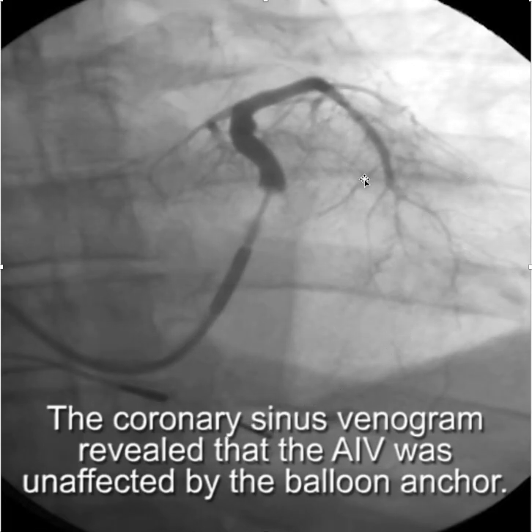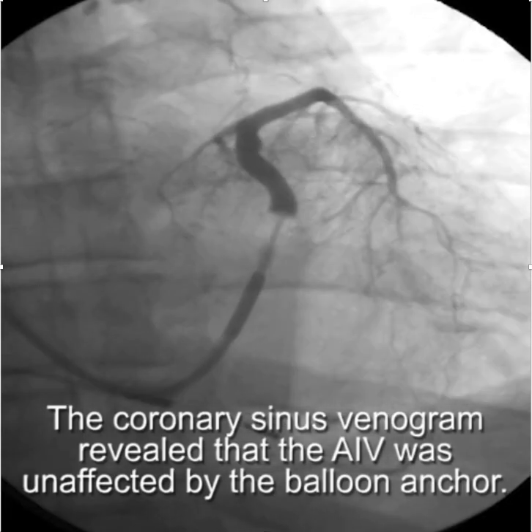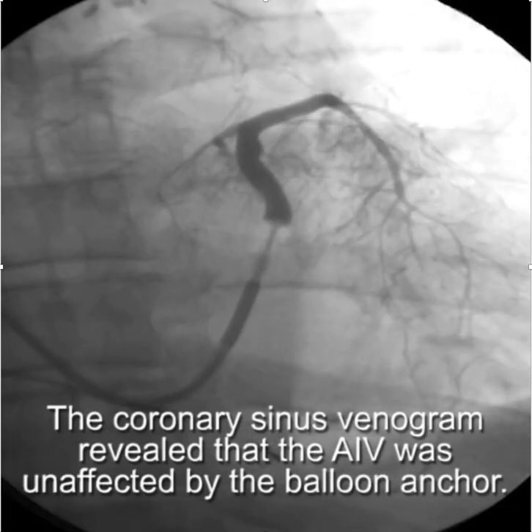You're probably concerned that we might have damaged the vein or caused a dissection, but you'll see here — this is where the balloon was — and you'll notice that there's no dissection or even disruption of the vein where the balloon was.